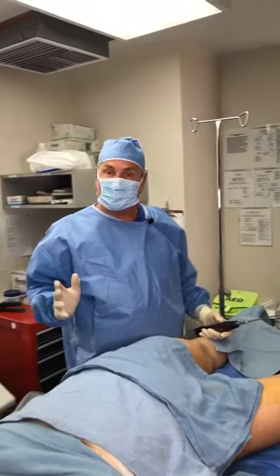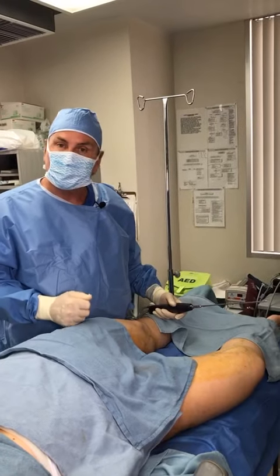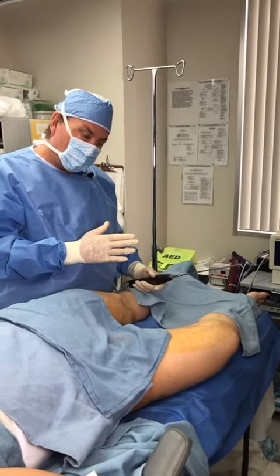Dr. Thomas Barnes, Newport Beach Cosmetic Surgeon, here in beautiful Newport Beach. Today we're contouring several areas of her body. We've done her tummy, her inner thighs, her hips, outer thighs, and now inner thighs.